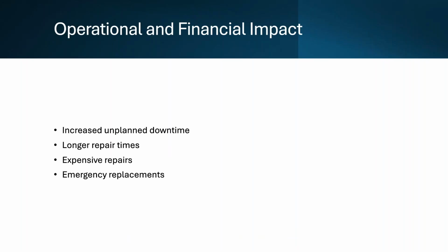If a critical device fails and can't be repaired, you may need to rent replacement equipment or purchase a new system on short notice, often at unfavorable times. HTM teams are often the first line of defense in managing these operational and financial impacts. By planning preventive maintenance schedules, tracking device life cycles, and advocating for timely replacements, you can minimize unexpected costs and disruptions.